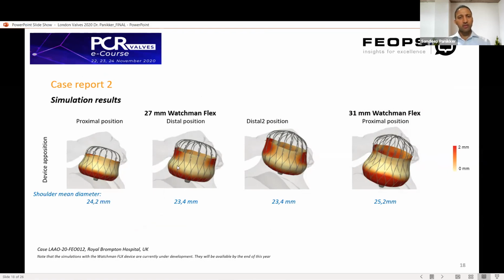What I wanted to do was ensure that I would cover the funnel, the wide opening of the appendage, without risking this rubbing against the distal appendage. Though, of course, as those of you who implant these will know, it's certainly a much better design now that the distal ends are closed off, much like the amulet, and that means you don't get the risk of the distal legs perforating the distal part of the appendage.